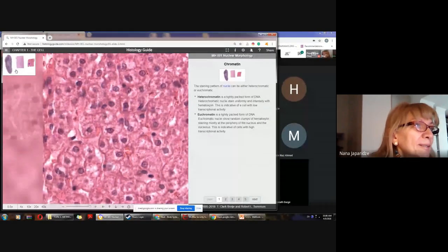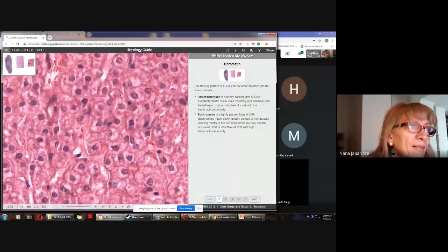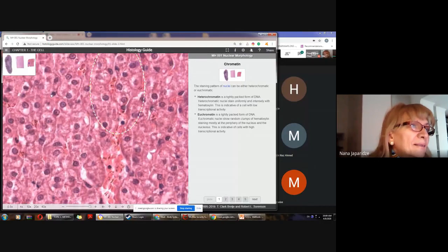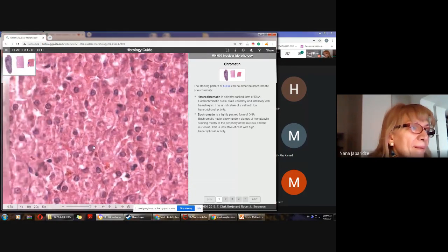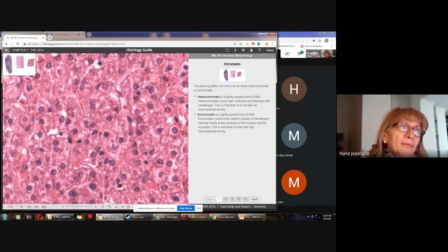Okay, so let's go to this, liver tissue. Cells, epithelial cells, a lot of cells. Again, blood vessel. Blood capillaries, look, profile of blood capillary. And these are RBC. Let's go to this, parenchyma of liver.